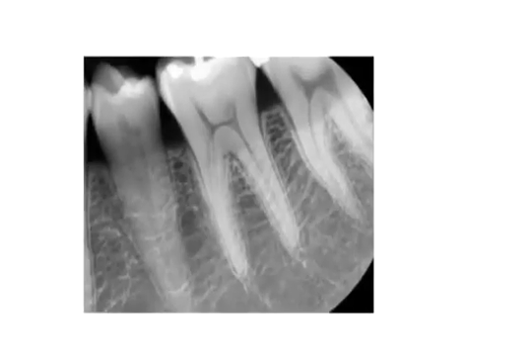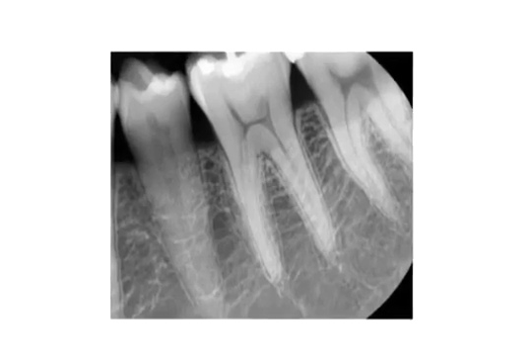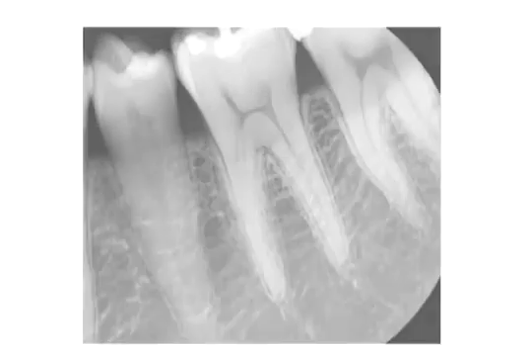This intraoral sensor is based on complementary metal oxide semiconducting technology with a fiber optic scintillator layer, contributing to excellent image clarity.